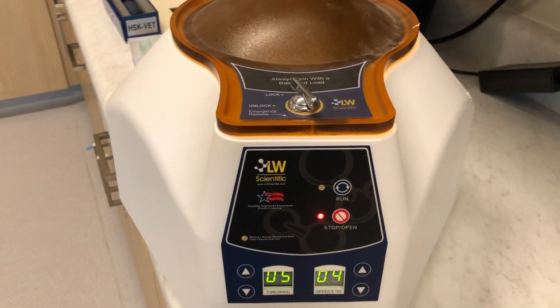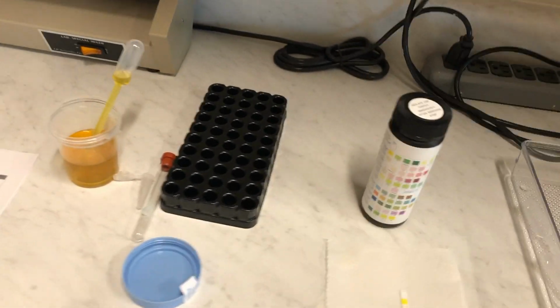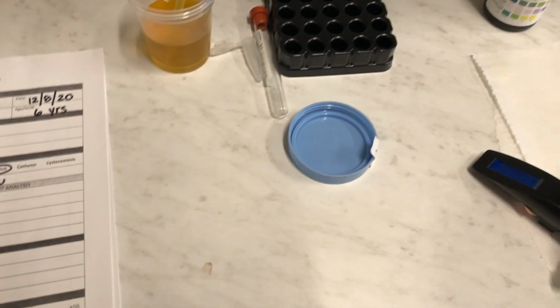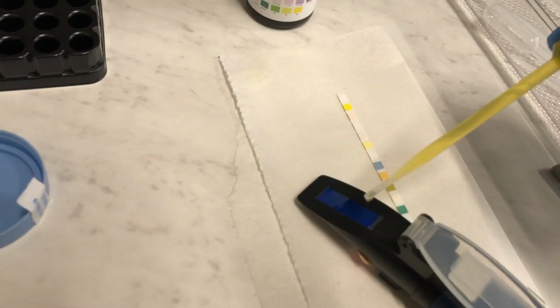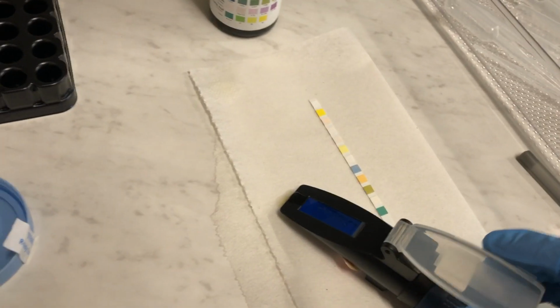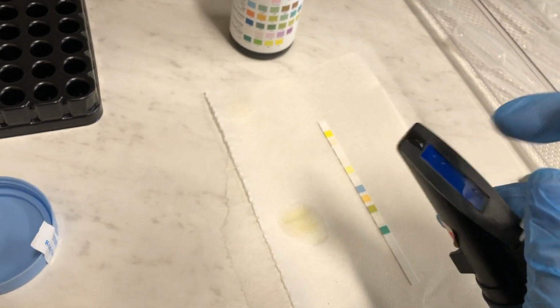So that sample is going to spin, and while that's spinning, I can come back and perform the rest of my urinalysis. So there's 2 more parts. We have to do the chemistry analysis on the dipstick, and then we have to do our urine-specific gravity on the refractometer. So the refractometer, you just want to lift open the window there, and you want to put a good size drop on the screen, and then close the window.